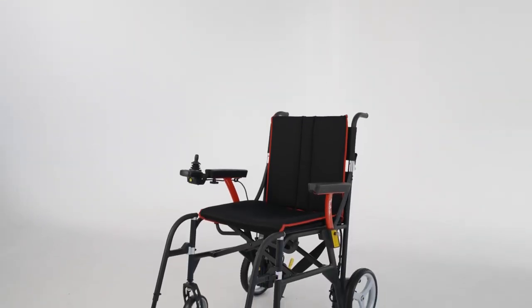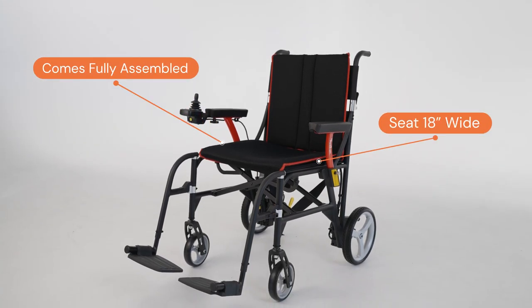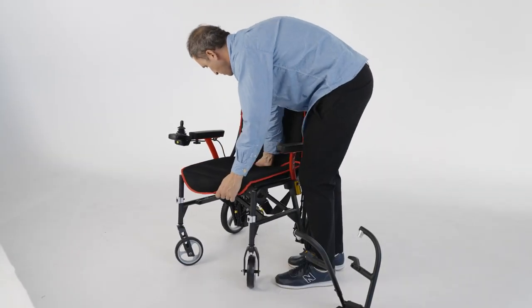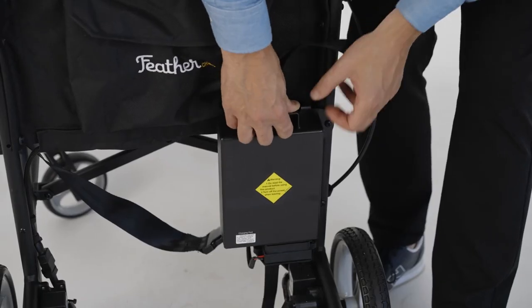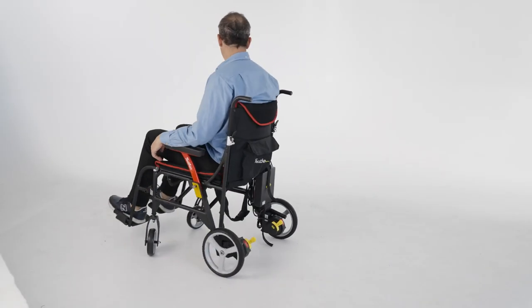Here's everything you need to know about your Featherweight Electric Wheelchair. First of all, it comes fully assembled. All you have to do is unfold it, place the cushions on, and hook in the battery, and we're off to the races. Of course, we recommend that you charge it up once before you go for your first ride.